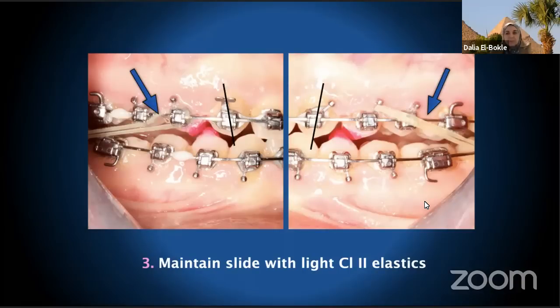During the daytime, sometimes the patient is adjusted to the new position, so there is no problem. I always train them to bite and slide forwards. And the next time they come to me to the office, they are biting just where I train them to bite. But what worries me is the night time, because during the night, the patient is relaxed, the mouth is slightly open, and the only way to maintain this position is by using the elastics. I prefer shorter elastics than the ones in this example.